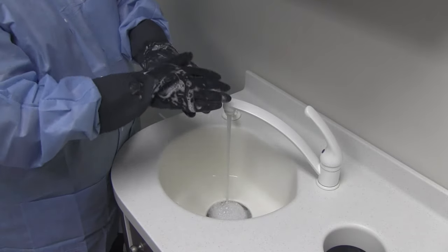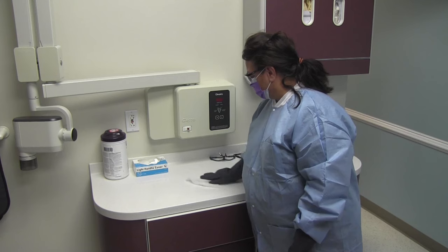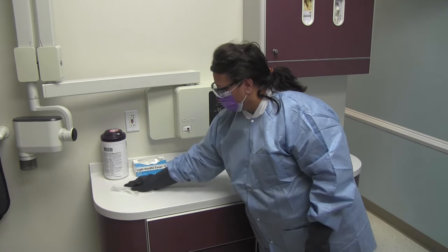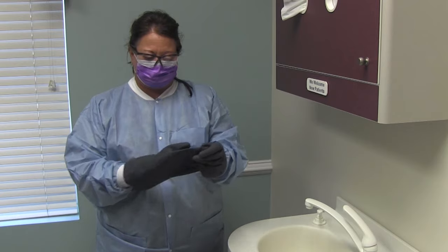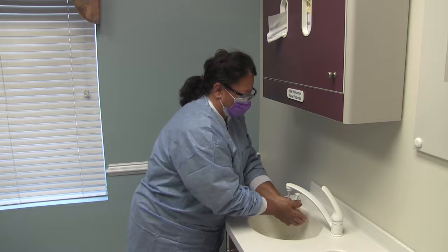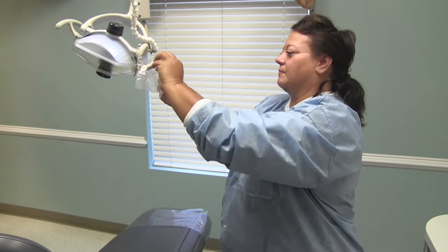Afterwards, wash and dry the utility gloves, but do not remove them. Clean and disinfect the surfaces in the dental room, even those that were covered by a surface barrier. Remove the utility gloves, wash and dry your hands, then apply new surface barriers ready for the next patient.